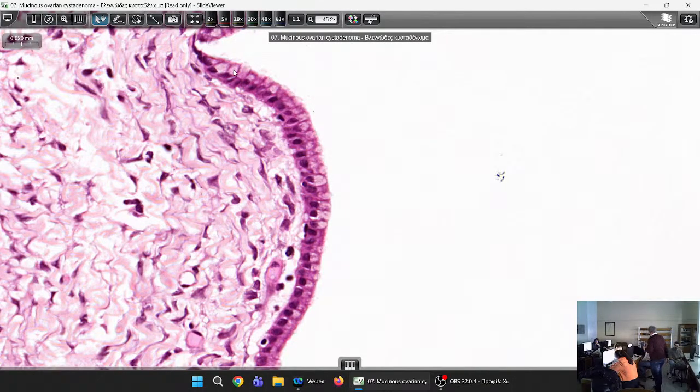And another type of ovarian tumors are the metastatic tumors, most times deriving from the stomach. These are diffuse, high-grade gastric adenocarcinomas, which can spread to the ovaries, metastatic spread, and these are known as Krukenberg tumors. And they involve the peritoneum as well.